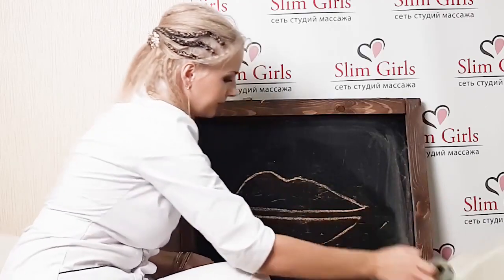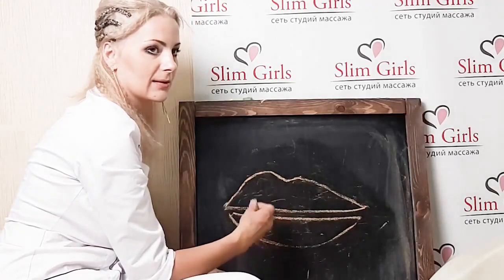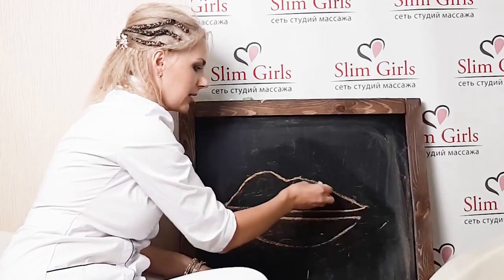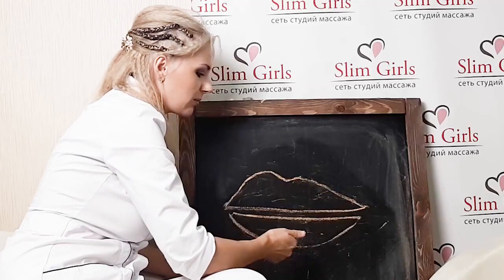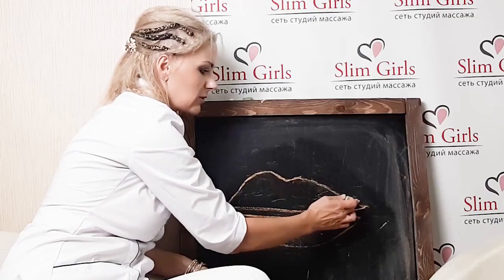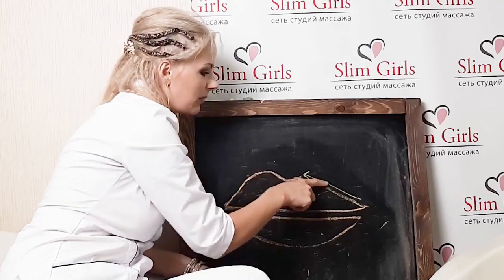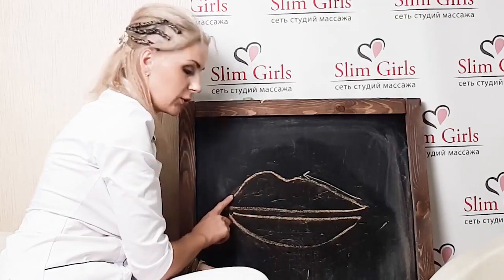The second way. When we see asymmetry, we can initially agree with the client that we will remove it. Imagine the usual injection of filler: you press the plunger and put a thin track. To eliminate asymmetry, you can go straight away not along the contour, but indent 1 millimeter and lead the preparation over the top, putting a little more pressure on the plunger to squeeze out more of the drug. And on the other side, we will put a thin line of drug.